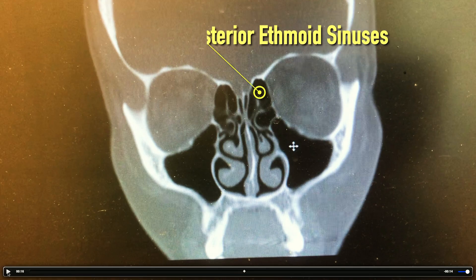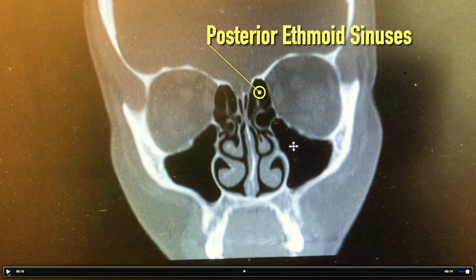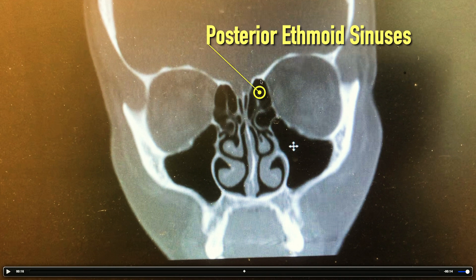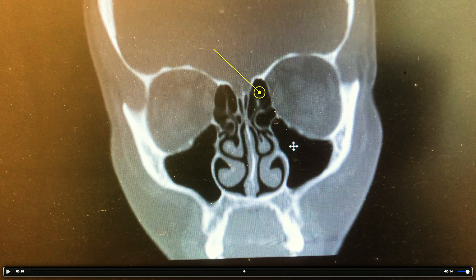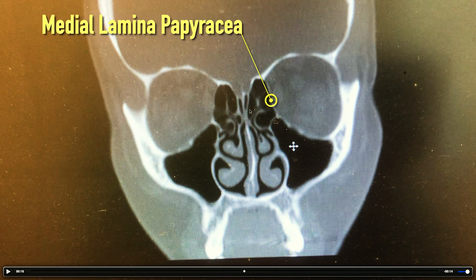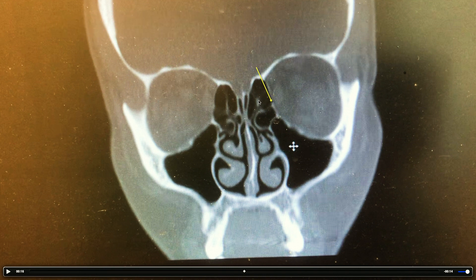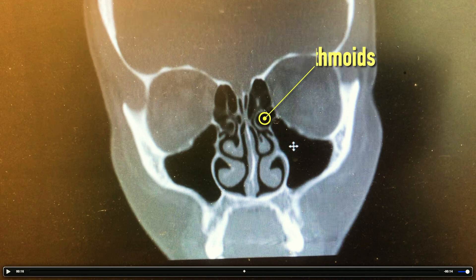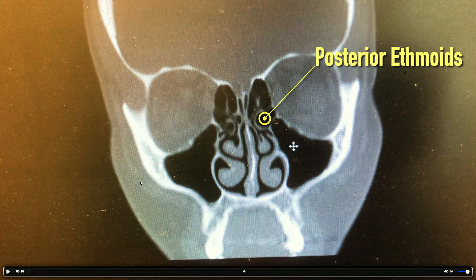Let's keep going further back. We're getting more into the posterior ethmoids. It's lined by the skull base up here. The eye socket right here — we call that the medial lamina papyracea. And here is the posterior ethmoids. Black. Here's some bony partitions right here. Totally normal.